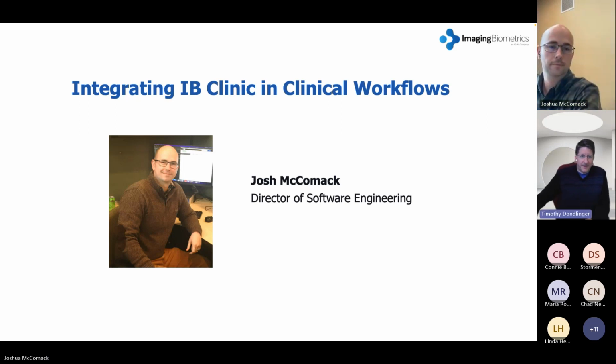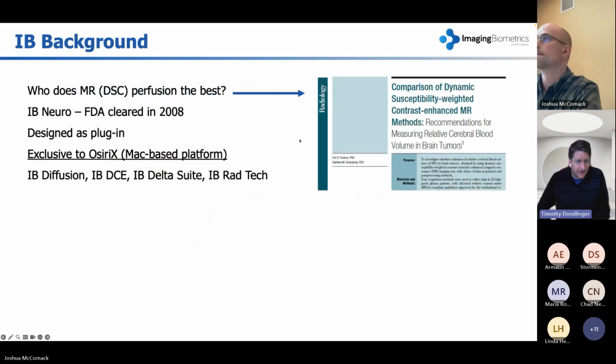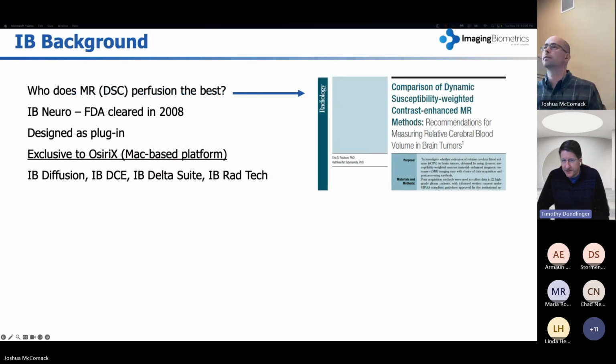Sounds good. Thanks, Josh. Here we go. We'll go through some background and information about the IB Clinic software itself. Real quickly, I know we have a wide mix of attendees here, some of whom are not familiar with some of the stuff we put out.